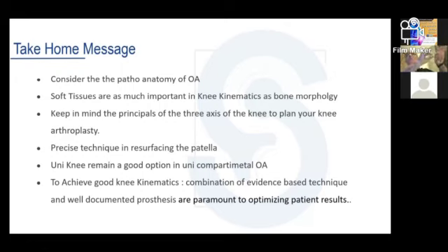You will see exactly where your prosthesis will fit, and the thickness, when you plan your total knee on the pre-op lateral X-ray. You know exactly where the prosthesis will be, and you will see it perioperatively. You can match exactly your planning and the template you have done in your work.